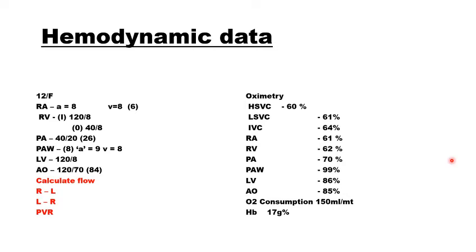Now, from the LA, there is a step down at the LV level. Only 2% is significant here. There is a significant decrease of the saturation. The systemic saturation has decreased.